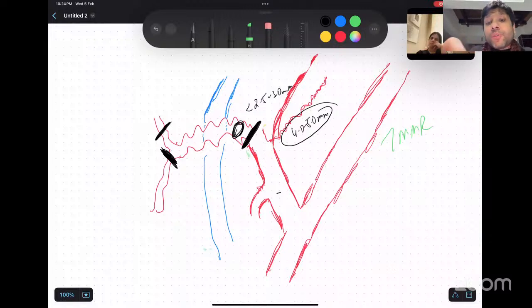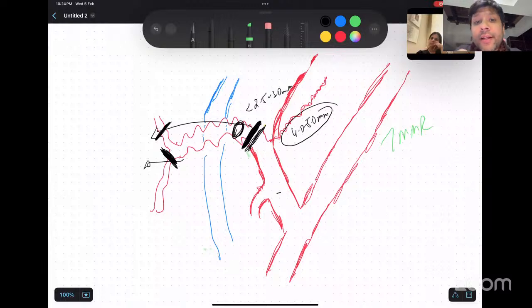If you want to expose the ureter, very simple: cut the uterine artery here at its origin and then lift the uterine artery in the medial direction. Automatically the ureter will get exposed, and that exposes something called the tunnel. But I will be discussing the tunnel in a different lecture altogether.